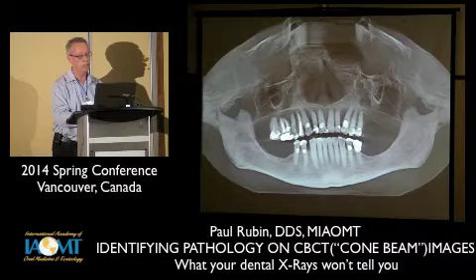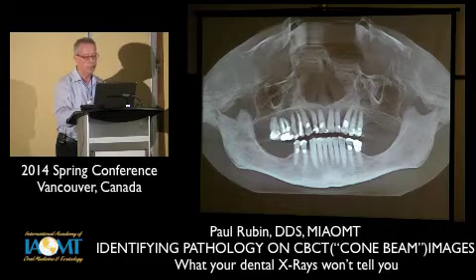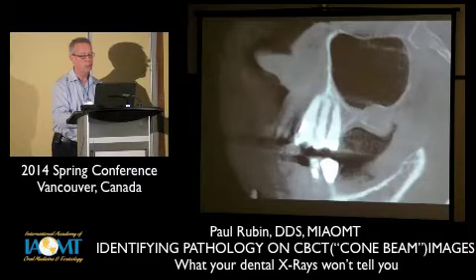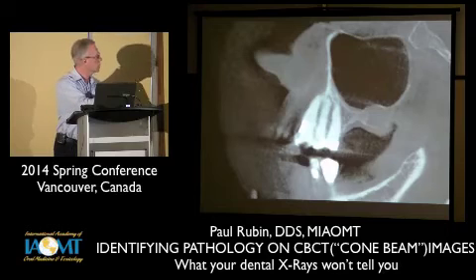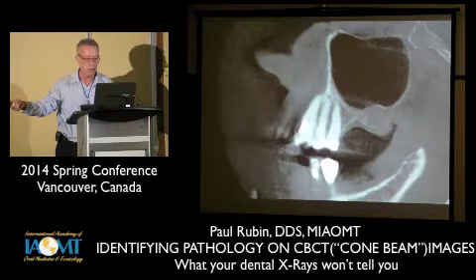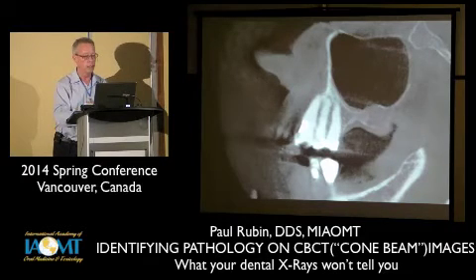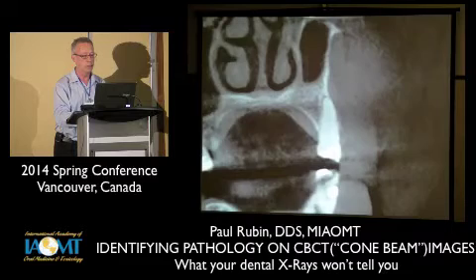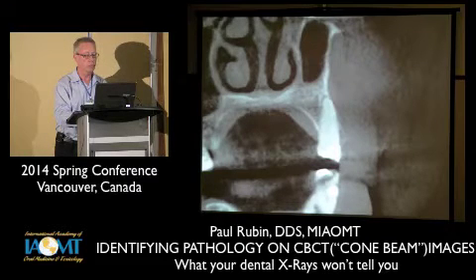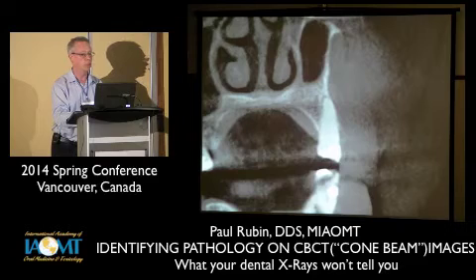We'll just take a look at the upper left here on these bicuspids, because it looked like something was going on here. Again, when we get the scan and we look at different slices, we can get to the point where now it's really easy to see this radiolucency on the apex of this bicuspid. You also can see a little bit of thickening of the sinus membrane here. When we look at a different dimension, we can see that radiolucency is mostly to the lingual of that apex, but pretty clearly diagnostic, and no question about this.